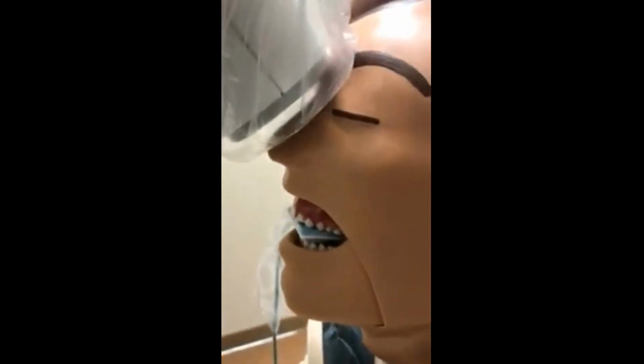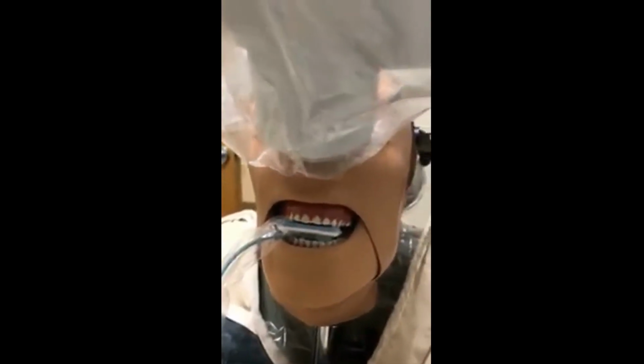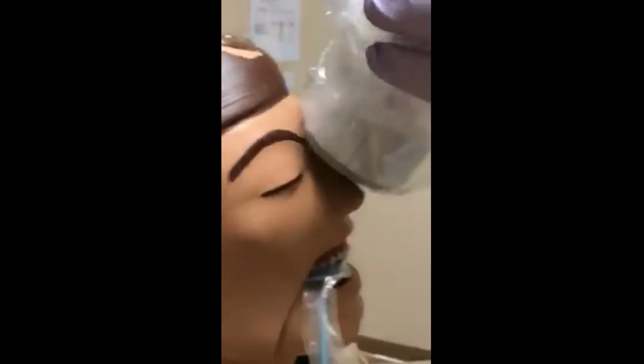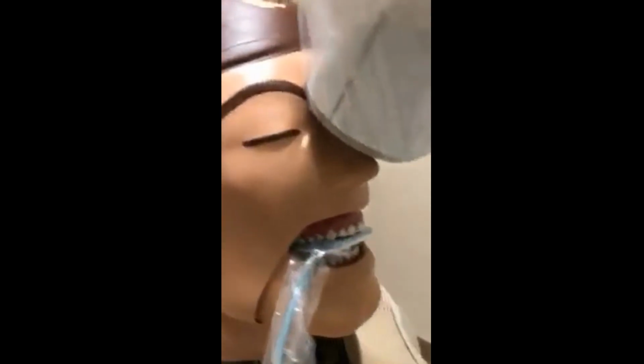So this means that the PID should be positioned such that the central ray is directed through the midline of the arch towards the center of the receptor, and that the top edge of the PID is placed between the patient's eyebrows and the bridge of the nose.